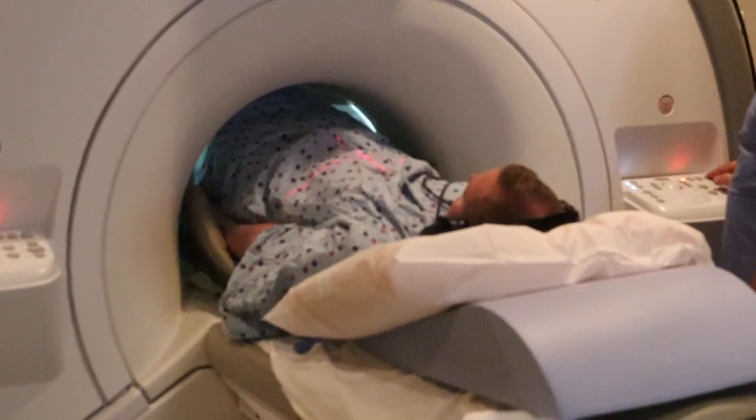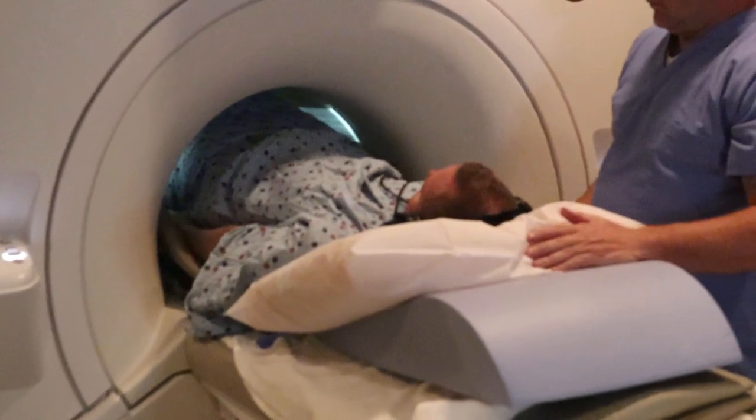Cushioning for the elbows so it's not in direct contact with the bore. Clear and advance to scan.